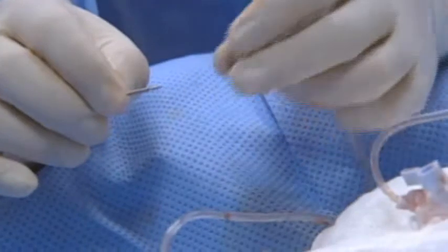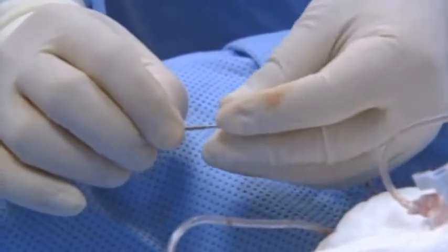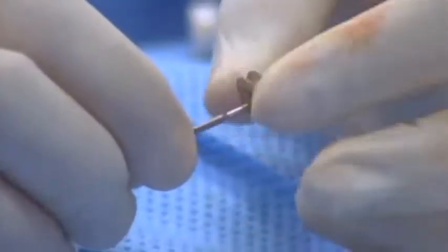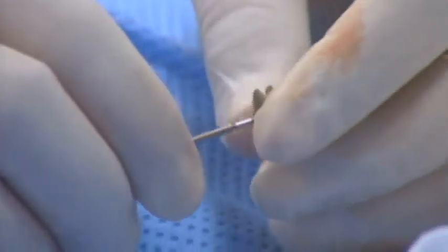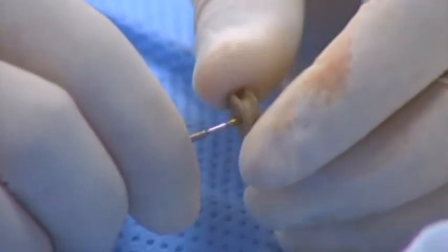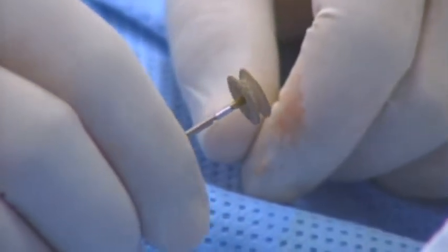This is a floppier device than the old Platzer perimembranous VSD device. So what size is that? This is an 8. We were discussing between 7 and 8, and based on the 3D pictures, we decided to go for an 8 because we had like 7 by 5. It was like a buttonhole kind of appearance on 3D TE. That's why we decided to go for an 8.